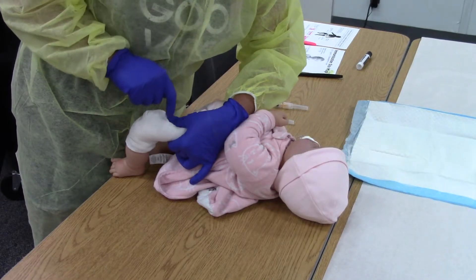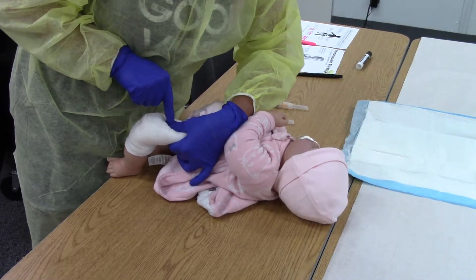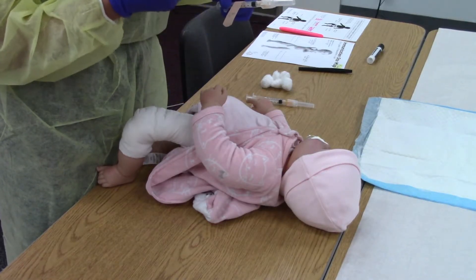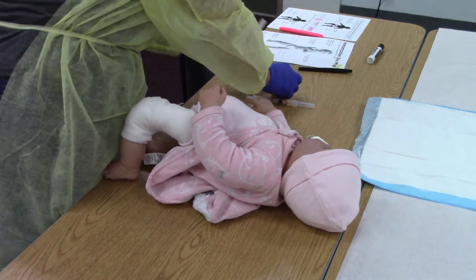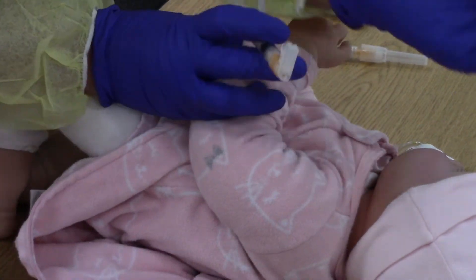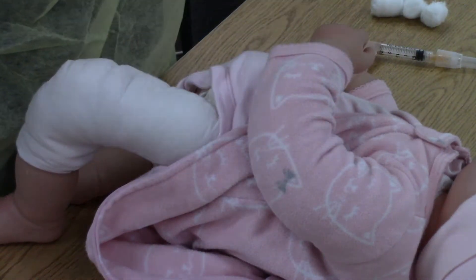Go directly straight down at a 90-degree angle — not sideways toward the bone, but straight down next to it. The bone is under my thumb and I go straight down beside it. I labeled my intramuscular injection on my paper so I know which one it is. We clean the baby, use a one-inch needle, and go in really quick — in and out that fast.